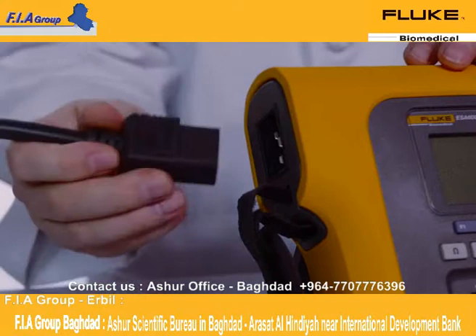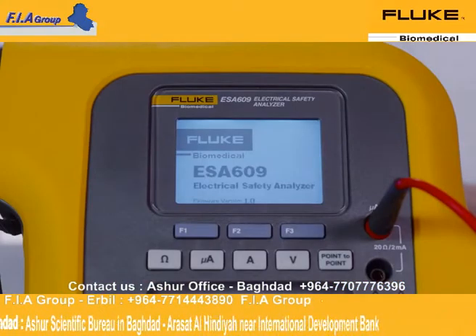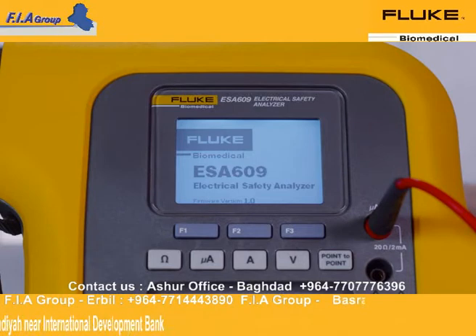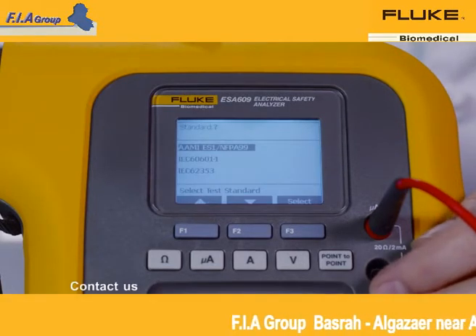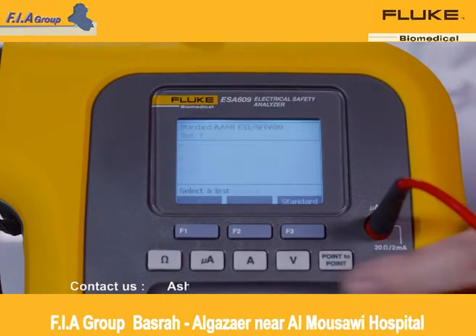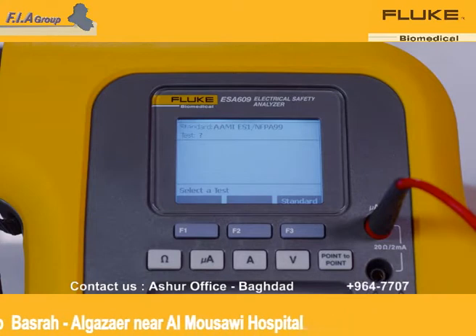To begin testing, plug the ESA-609 into an outlet. The ESA-609 will perform a series of self-tests and prompt you to select a test standard. For the purpose of this test, we'll select the AAMI-ANSI-ES1. Today, we'll perform a chassis leak test on this infusion device.